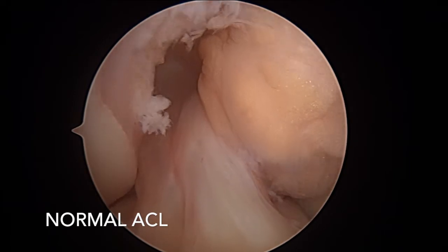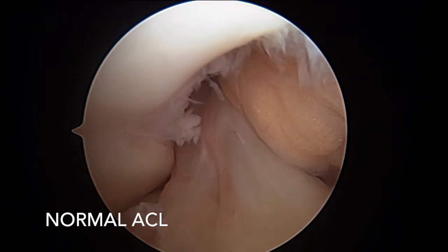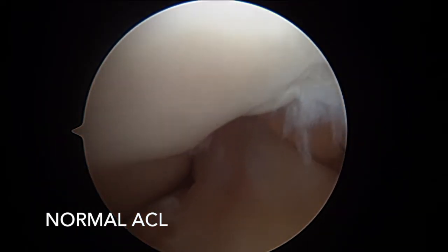This is a surgical video of a normal ACL as the knee is slowly extended and then flexed again.